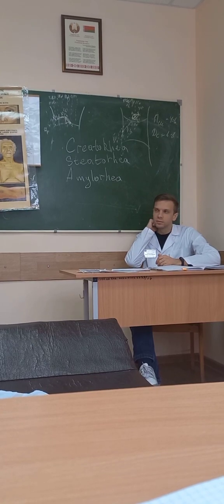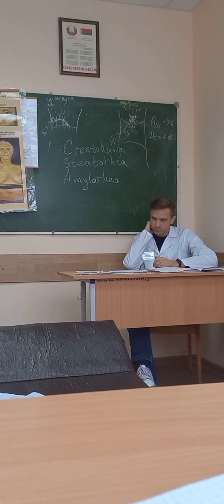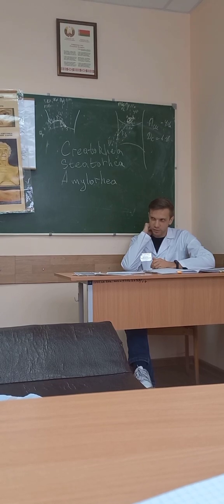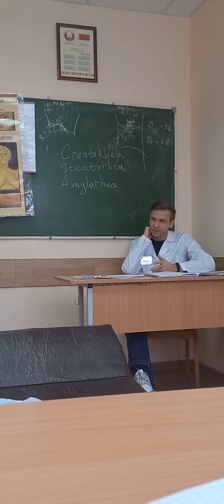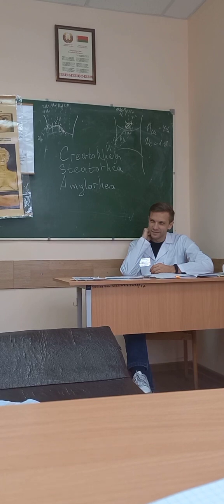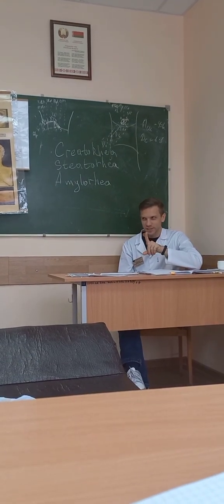Consistency formed, shape cylindric, color brown, reaction slightly alkaline, smell fecal, hidden blood absent. So it's putrid dyspepsia? Is the smell normal or putrid? Smell is fecal. But why putrid dyspepsia? Because it's slightly alkaline. No. Slightly alkaline is normal. Only an alkaline reaction is not disease yet.